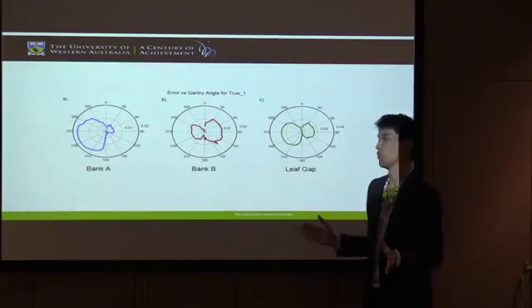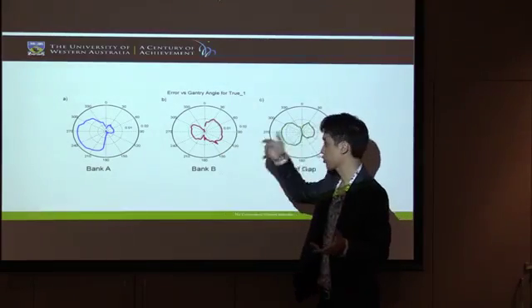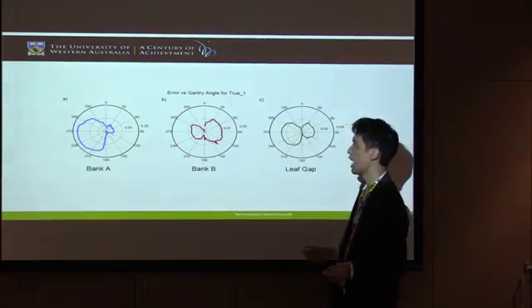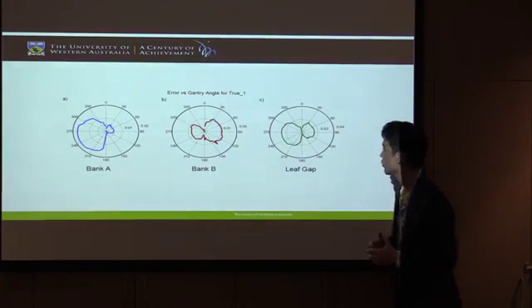And I've done that with all of it. Then I split it up into gantry arcs, the control points like 0 to 2 degrees, 2 to 4 degrees, 4 to 6 degrees, etc., all around, and I averaged all the error in there, and I got this kind of point.